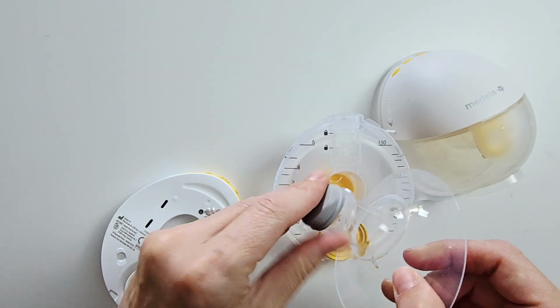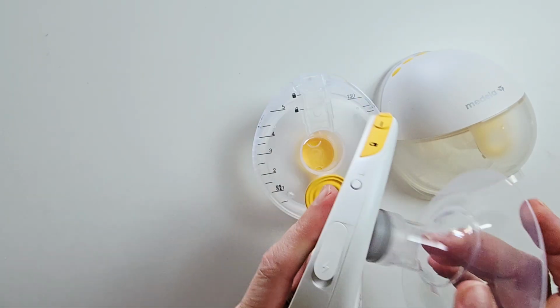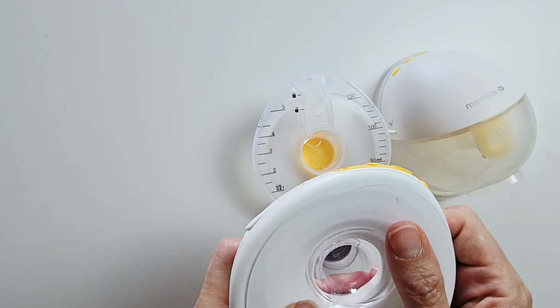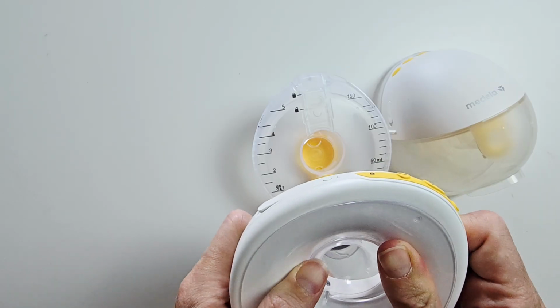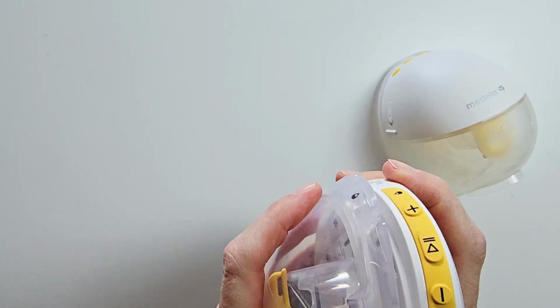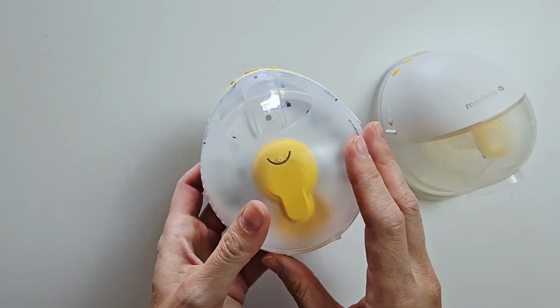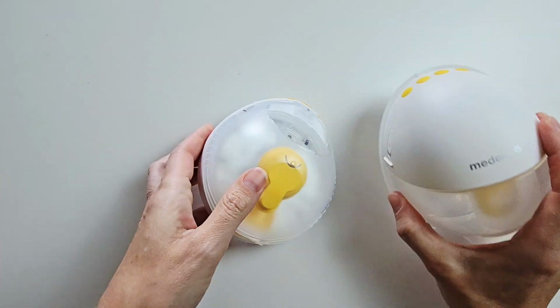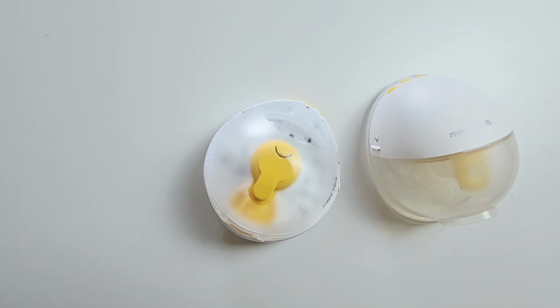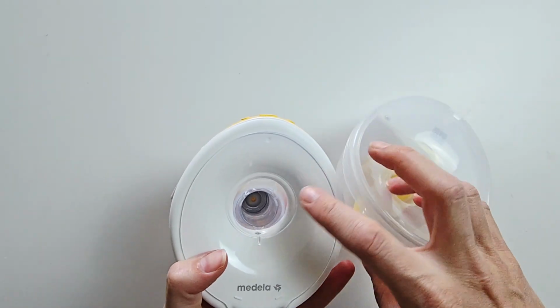You just have a lot more of these silicone parts that come with the Motion. That's your pump motor. But again, it is really nice and streamlined. So that is a big advantage and something to consider. But there are more parts. There are more soft silicone parts that will wear with your Motion versus just the 3 parts with the Magic.